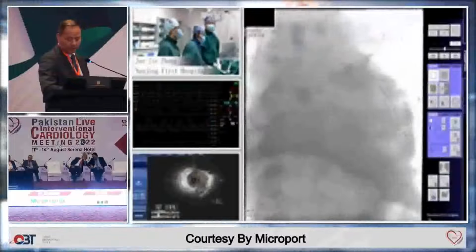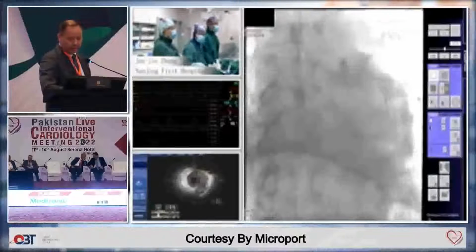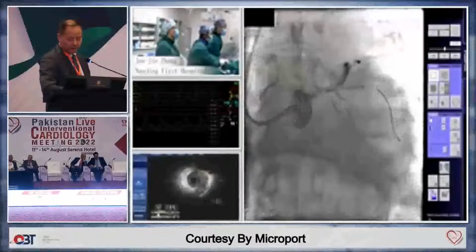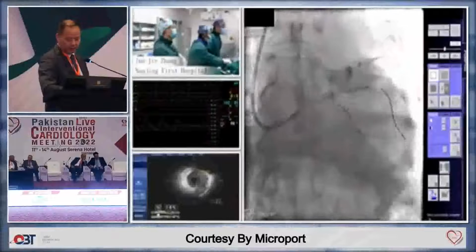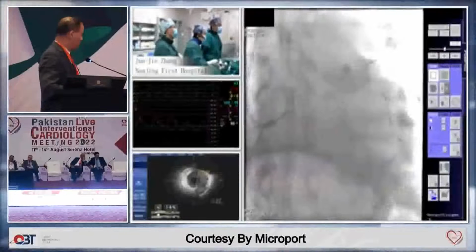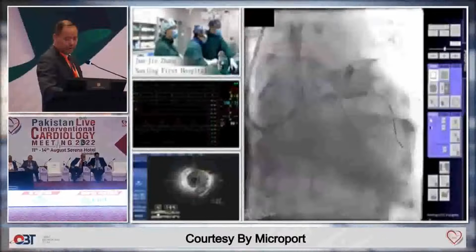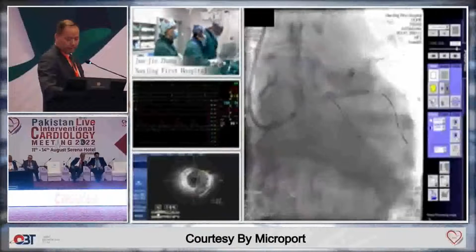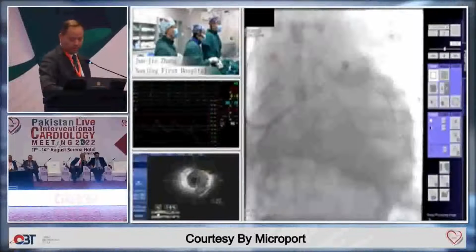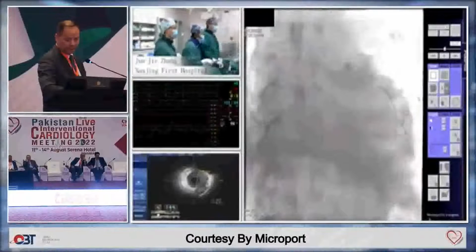Okay, we can hear you. There is no signal. We lost the signal. Can you hear us? Can you hear me? Jinjie, why did you choose to go to the native circumflex rather than the OM? Was that because of the angle? Now no connection. No audio. Jinjie, can you hear me? Yeah, we just lost the signal. Now I can hear you clearly.